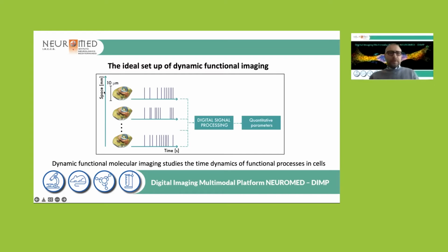Yes. So here on the y-axis is the space, and on the x-axis I have the time. The space represents the size and distance between single cells, and the time represents some messages sent by the cells, some signals. Imagine we have a very nice technology which can tackle a metabolic process within the cell, and exactly when this metabolic functional process is happening, we get a very clear spike.